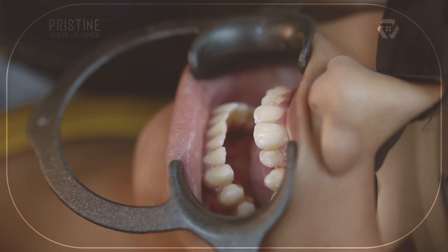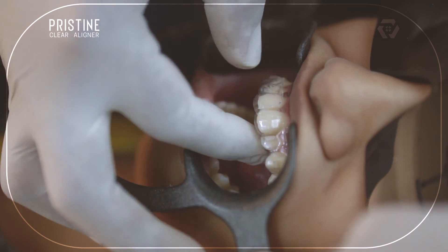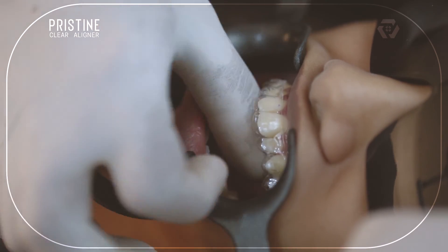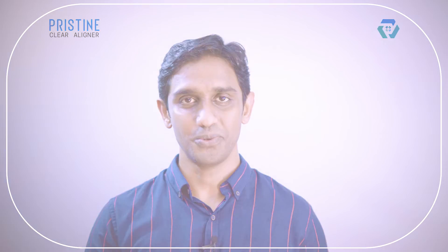Then place the initial aligner on the teeth and check for adaptation. Initially, the aligner will be a bit tight and will become easily removable within one or two days. Pristine provides an instruction chart to the patient in which removal steps are explained. A detailed video on aligner removal is coming soon, so stay tuned.